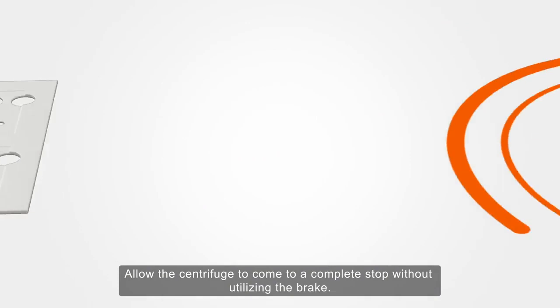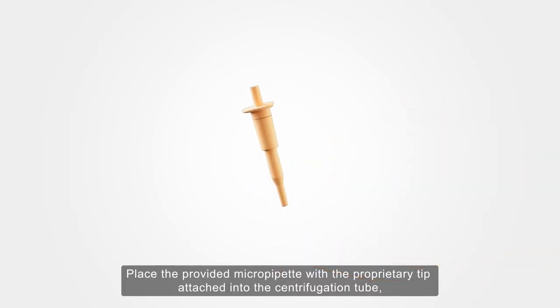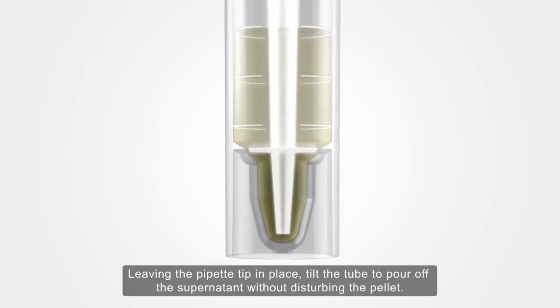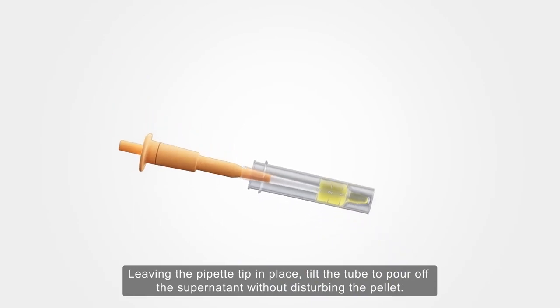Allow the centrifuge to come to a complete stop without utilising the brake. Place the provided micropipette with the proprietary tip attached into the centrifugation tube, seating the pipette tip stopper in the lower portion of the tube. Leaving the pipette tip in place, tilt the tube to pour off the supernatant without disturbing the pellet.